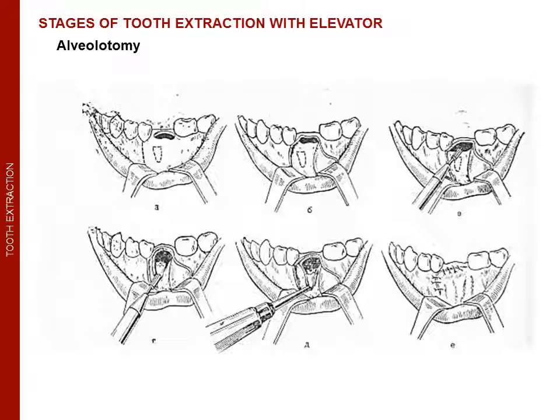Alveolotomy. Alveolotomy is the removal of a part of the alveolar process, often the interradicular septum, to give the bone the correct contour. Sometimes it is used as a stage of surgical access to penetrate into deep areas of the bone, for example with atypical extraction of teeth.